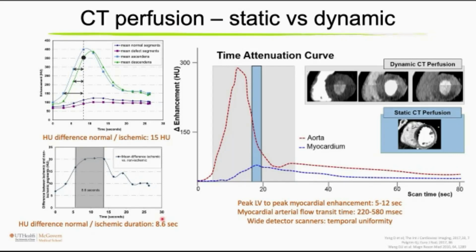So timing of where we take the picture to capture the short-lived difference and the small difference between normal and ischemic myocardium becomes a critical issue. In our institution, we do static perfusion only. We acquire in diastole. We try to get the timing right to be somewhere here.